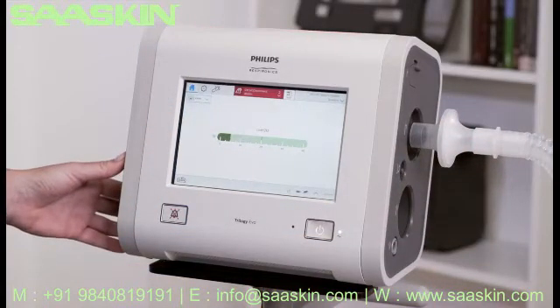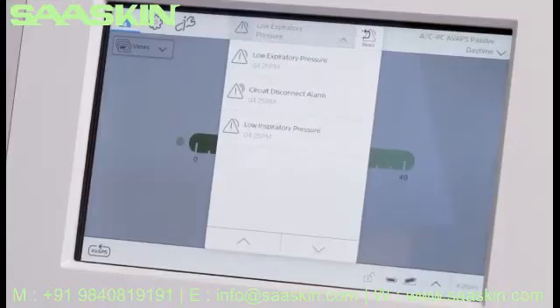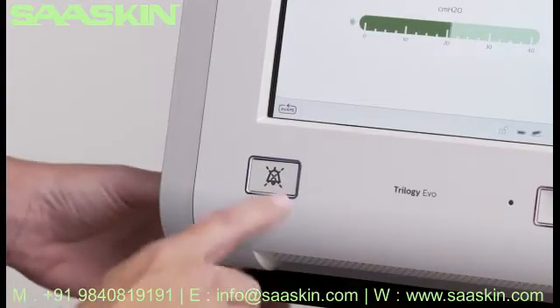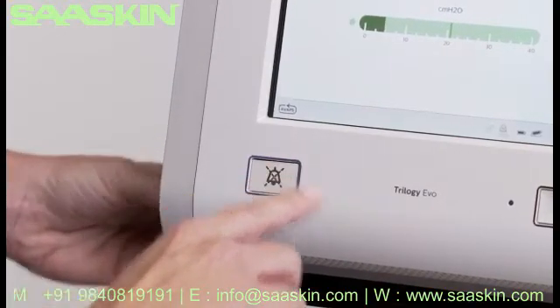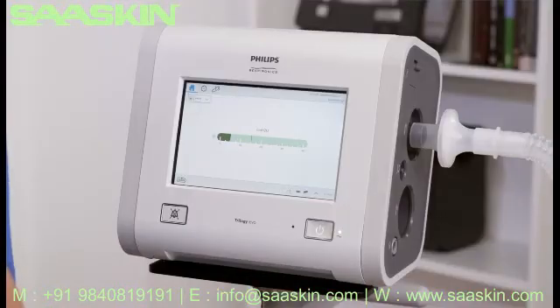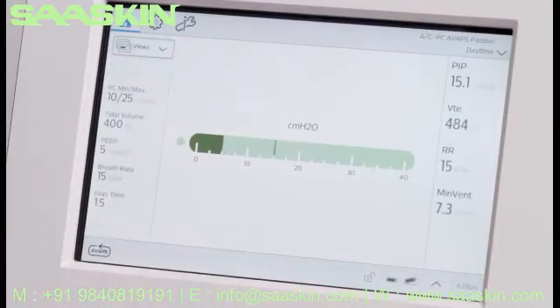To learn more about the alarm, tap the Alarm List. Since the alarm has resolved, you can tap the Alarm Reset icon. There is also an Alarm Silence button to mute audible alarms for two minutes. A variety of monitoring views are available. Some offer more details than others, depending on whether you are in full or limited access.